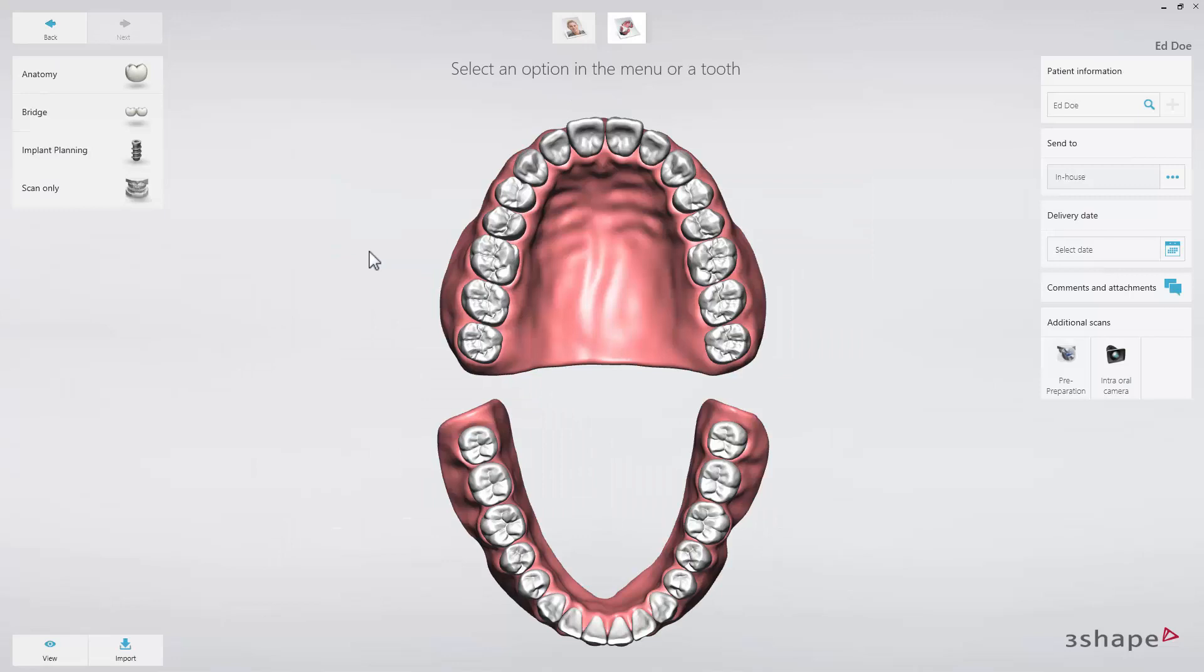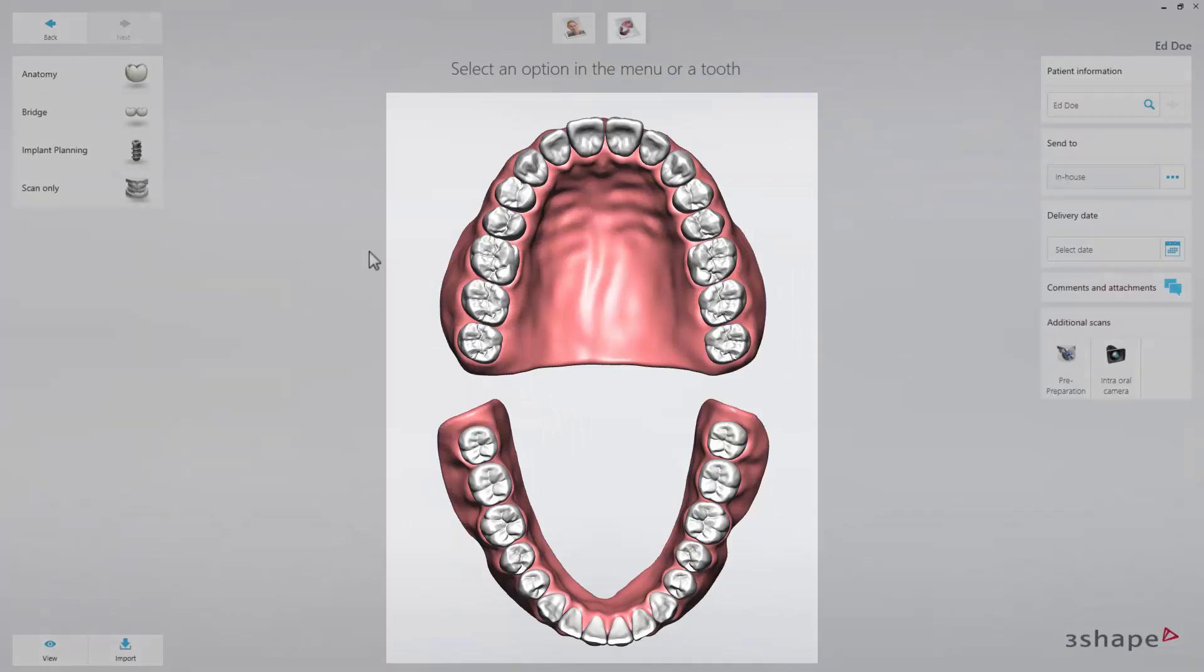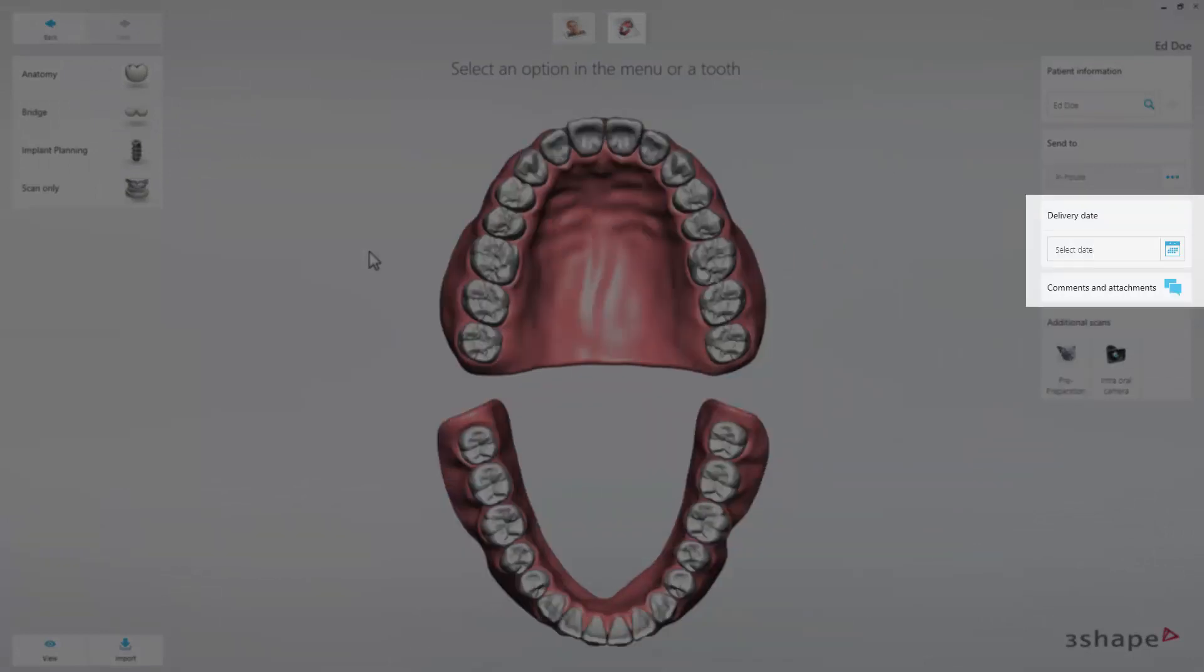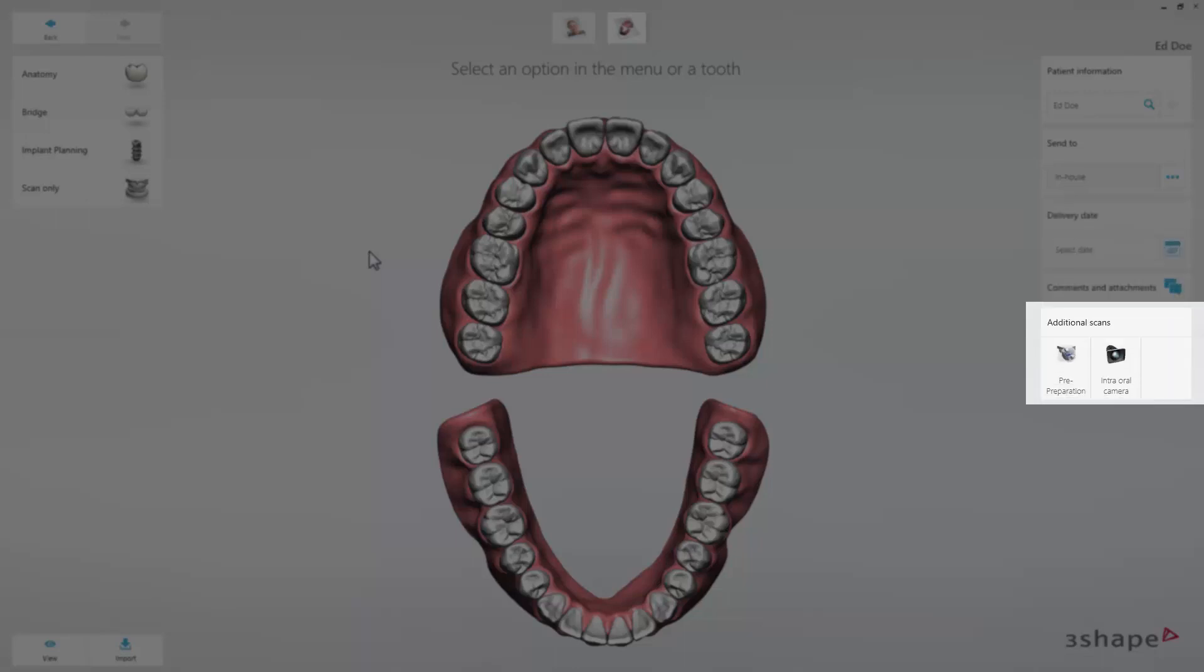You can now fill out the 3D order form by choosing the tooth or teeth involved and which indications you wish to do. You can also add comments, a delivery date and time, and indicate if you will add any additional scans to this case, a pre-preparation scan or an intraoral camera image.